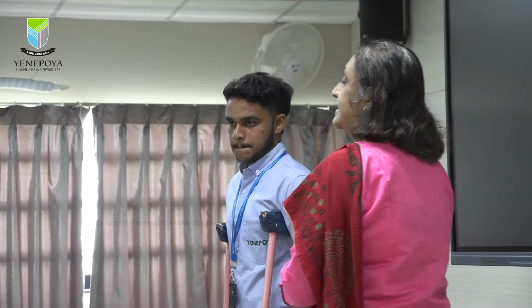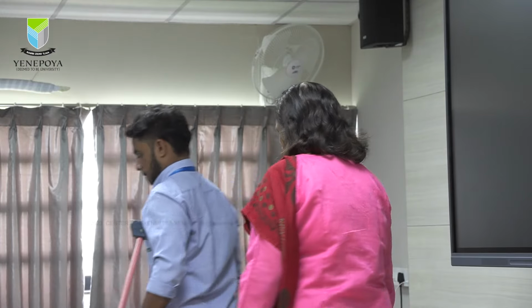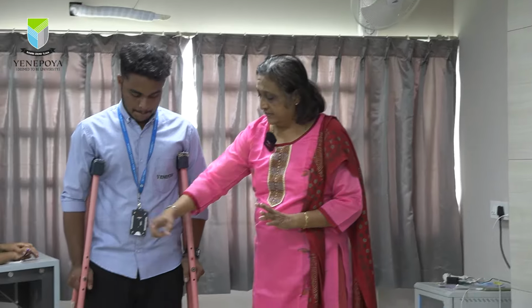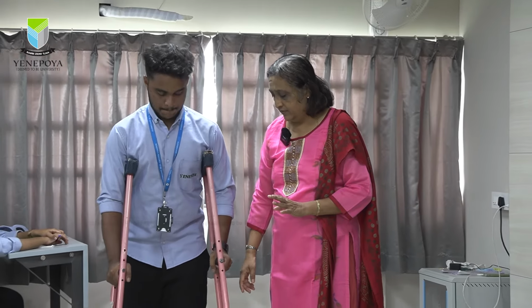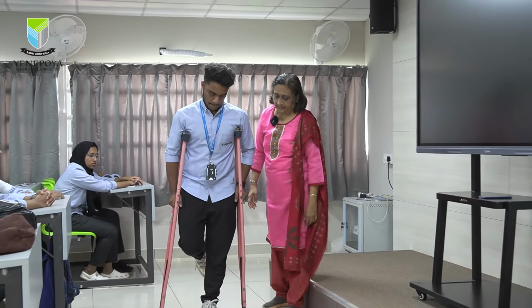Now, as I said, another pattern in this is the swing through pattern, which the patient adopts whenever he is comfortable with it. Now, in the swing through gait, 1 crutch forward, the other crutch forward, and go through, more beyond that.